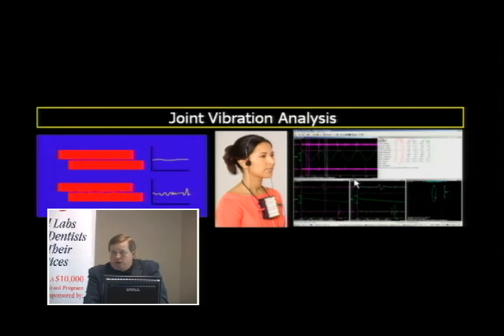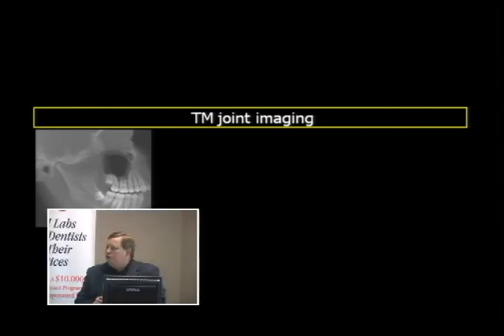Again, a great tool, but it's like load testing, it's like Doppler, it's a screening tool. You cannot definitively diagnose with any of them. Doesn't matter what it is. The only way to definitively diagnose is with joint imaging. And you know, you think about it, as a profession, it's amazing when you take a look at dentistry how we have resisted imaging the joints over the years.